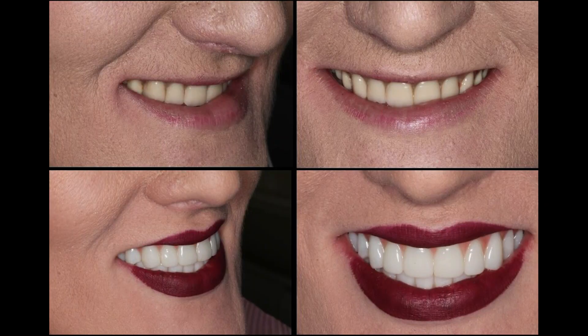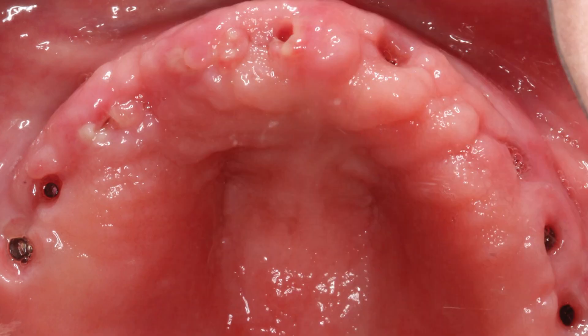The following case illustrates how the decision of whether to use multi-unit abutments can affect the design and delivery of the fixed full-arch implant restoration. The implants were positioned at angles that required correction, and the prosthetic connections needed to be elevated to the soft tissue level. Nine Han tapered implants from Glidewell Direct were placed in the upper arch and allowed to heal. When the patient returned, several of the implants were partially covered by the rapidly collapsing mucosa, making it apparent that multi-unit abutments would be needed, both to raise the prosthetic connection to the tissue surface and to make adjustments in angulation.